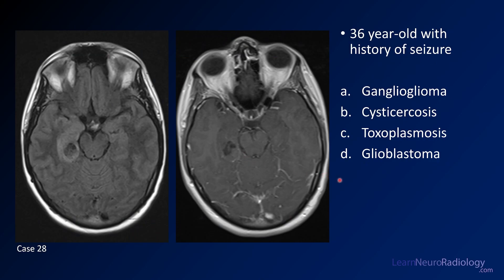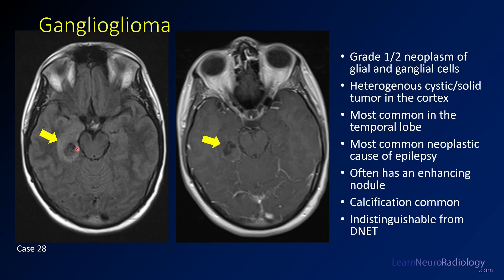Case number 28: a 36-year-old with a history of seizure. FLAIR and post-contrast images. Choices are ganglioglioma, cysticercosis, toxoplasmosis, or GBM. The answer is ganglioglioma. There's a predominantly cystic lesion in the medial temporal lobe with a little surrounding FLAIR signal and minimal enhancement. Gangliogliomas are low-grade tumors, usually grade 1 or 2 — cystic, sometimes with a nodular enhancing component. They tend to be indistinguishable from DNETs. In a testing setting, if you see a nodule of enhancement, call it ganglioglioma; if not, call it DNET. These are the most common neoplastic causes of epilepsy — think ganglioglioma or DNET in a young patient with seizure and a tumor.